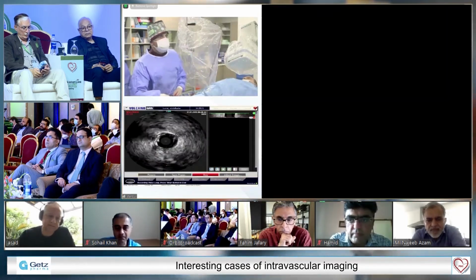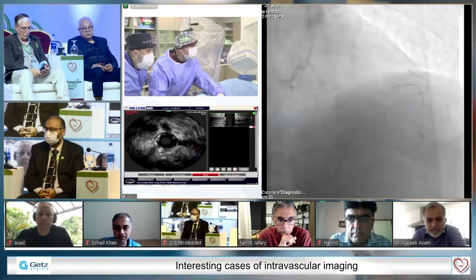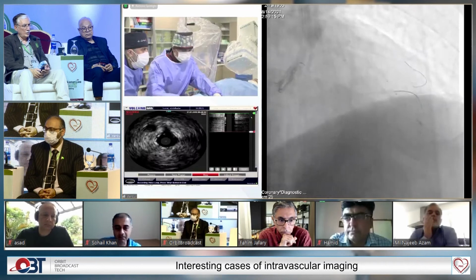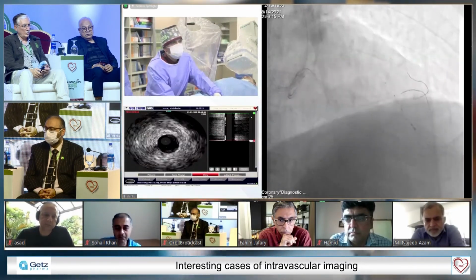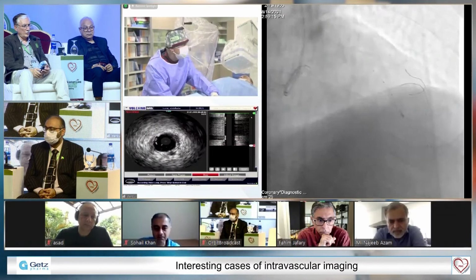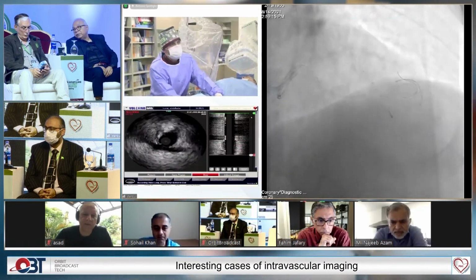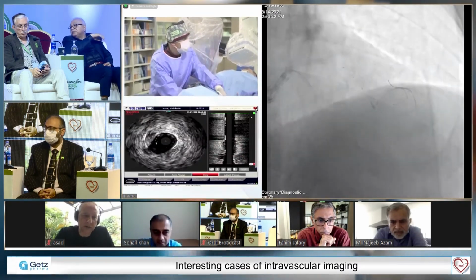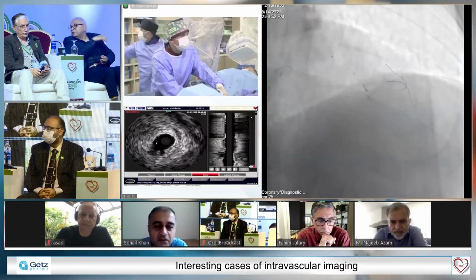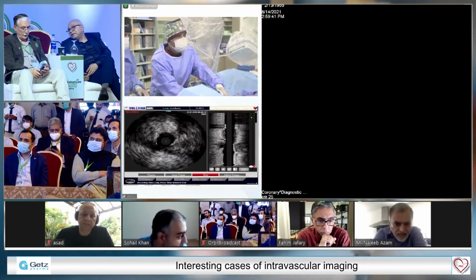Please show the IVUS now. Thank you very much. This is 2.5, around 2.5. Yes. Yeah. Almost. Here is almost 3.0. I still don't see the IVUS on the main screen. Mind putting it up, please? Show the IVUS on the main screen, please.